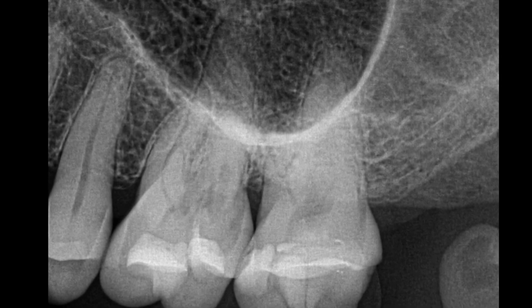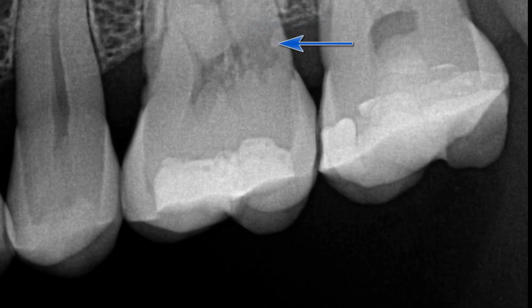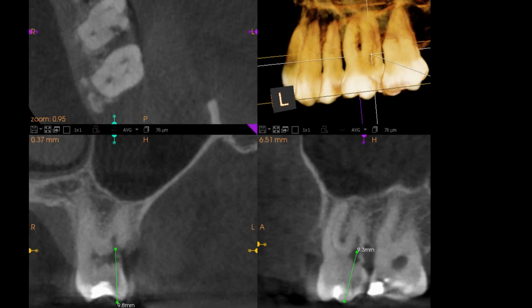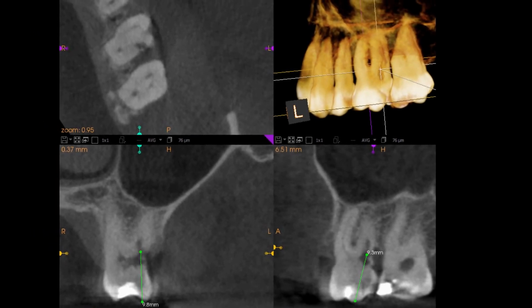Now, I routinely will take a periapical radiograph, but if you notice the bite wing, it shows a better view of the resorption defect. Even better is the cone beam CT, where we can get the actual 3D geometry and measure our angles and distances to the defect, which are extremely helpful as we begin access and triangulate for an internal repair.